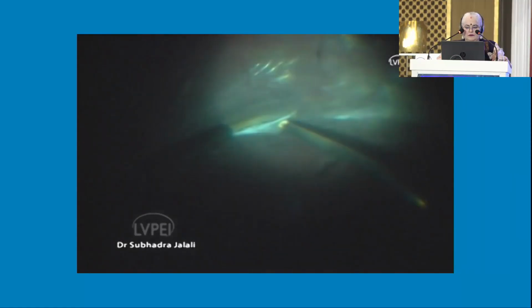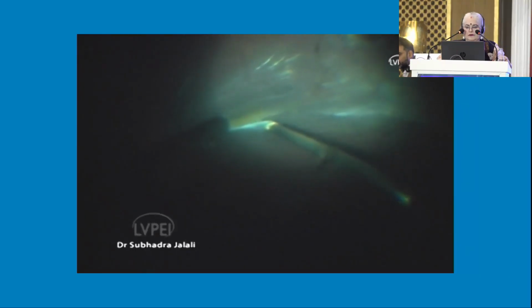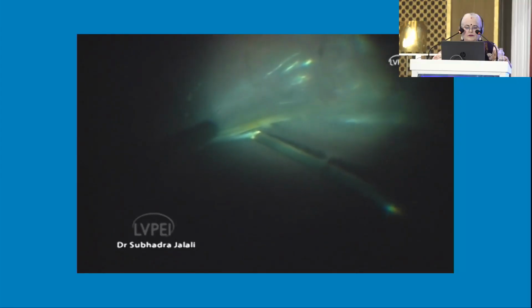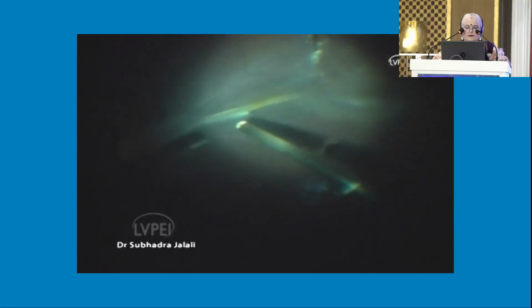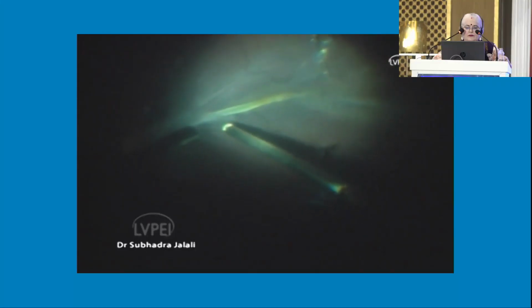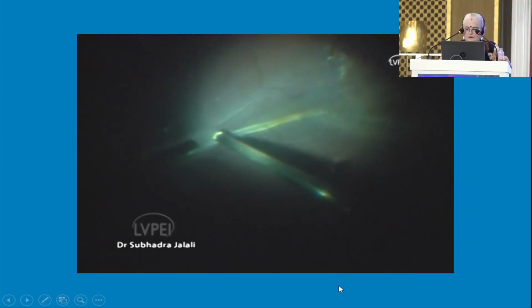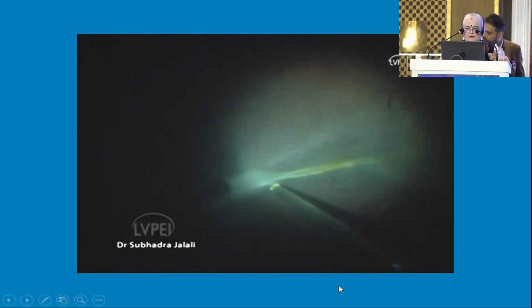Near the fovea, there will always be a very dense attachment. You can use a scissors or a bimanual technique, or if you are deft, then you can definitely release that traction slowly around the fovea, as you see here. So there will be a stalk and there will be surrounding vitreous which is causing that fold. Be extremely careful not to eat away that fold of retina and create a disaster. So slow trimming of the stalk will relieve the traction.